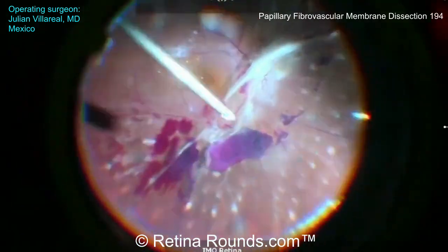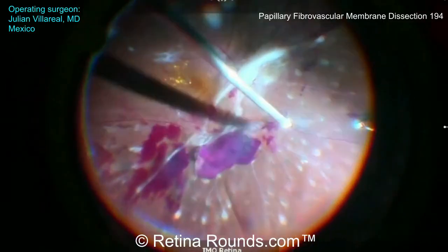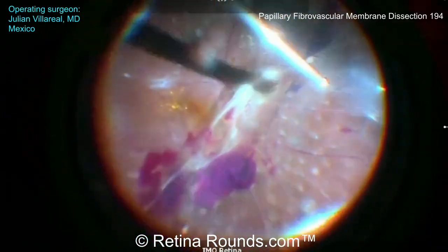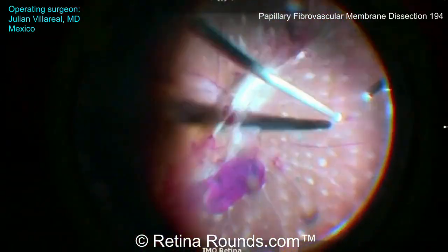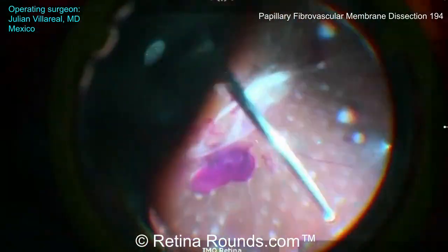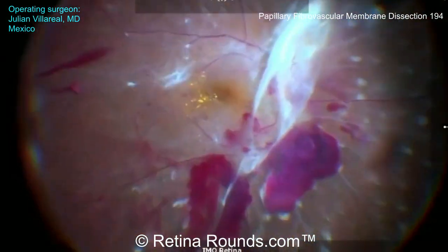Dr. Villareal is taking an outside-in approach, working to elevate the hyaloid in the midperiphery. You can also see here some recently applied PRP spots, which were likely performed preoperatively to decrease active proliferation and thereby decrease the risk of intraoperative bleeding. This also helps to create some early chorioretinal adhesions that may decrease the risk of retinal detachment during delamination and segmentation.